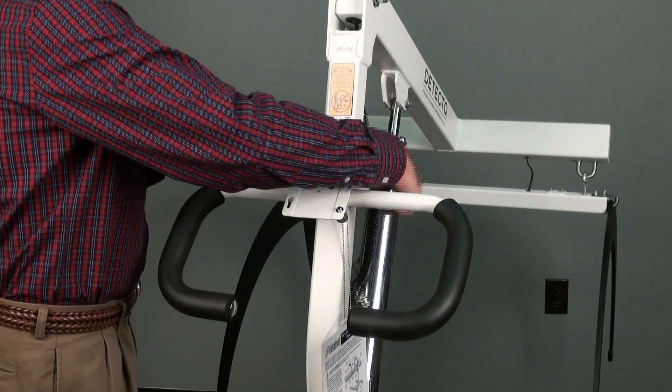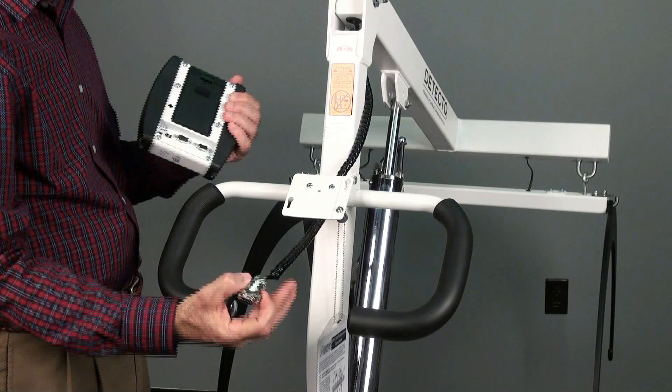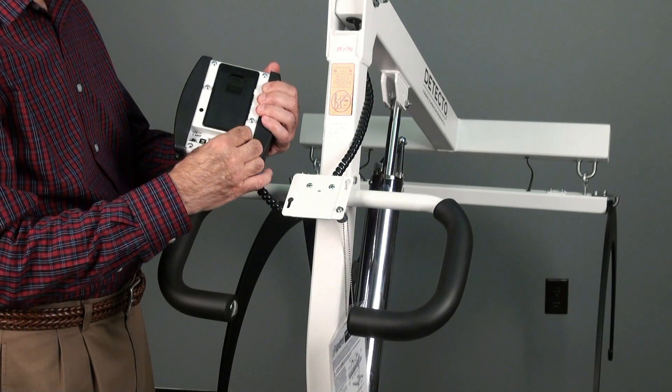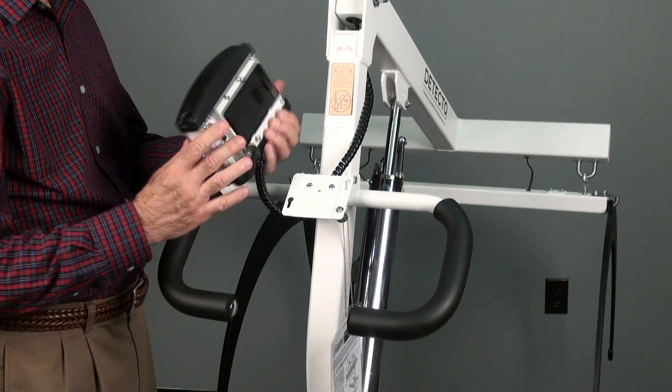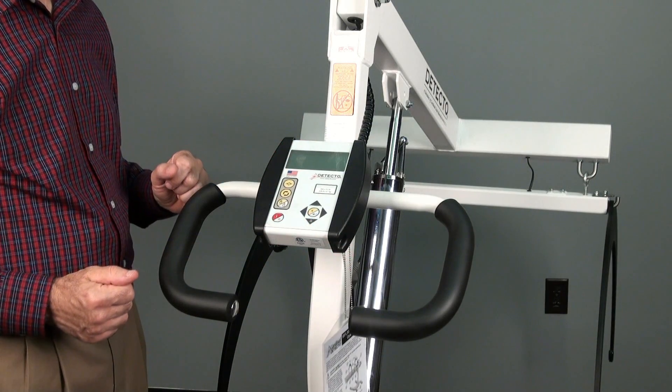To attach the 750 indicator, simply run the load cell cable around the column and through the bracket. Plug it into the back of the indicator and tighten the cable connecting screws. Then slide the indicator into place on the mounting bracket until it locks in place.